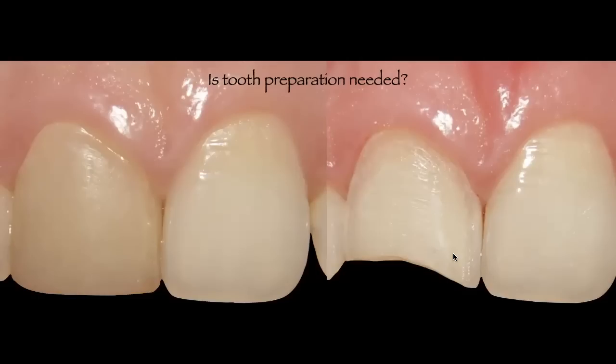On the other hand, if the tooth color matches the substrate of that prepared tooth, matches the surrounding environment, you do not need to prep as much because there's less that you have to compensate, because there's nothing that you need to hide. There's nothing that you need to mask.